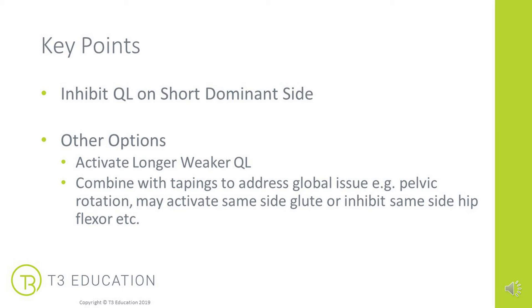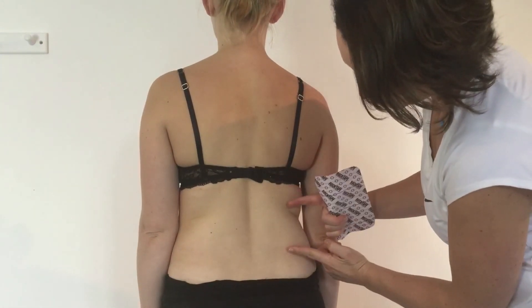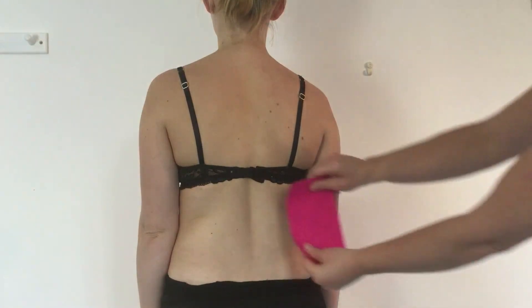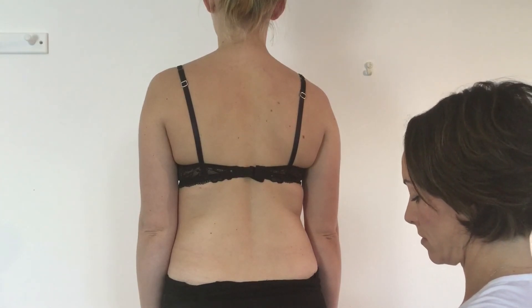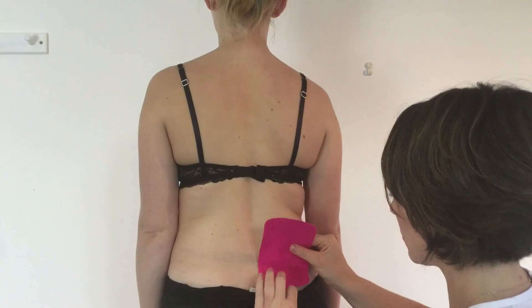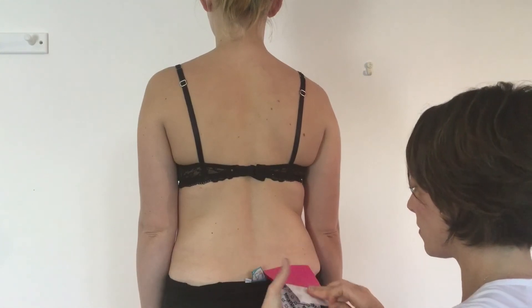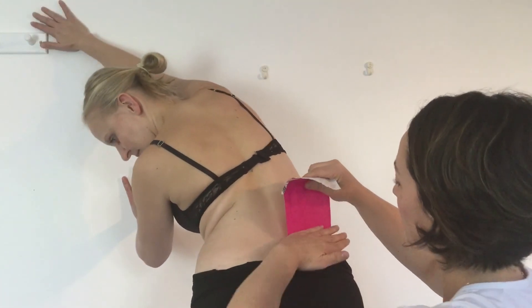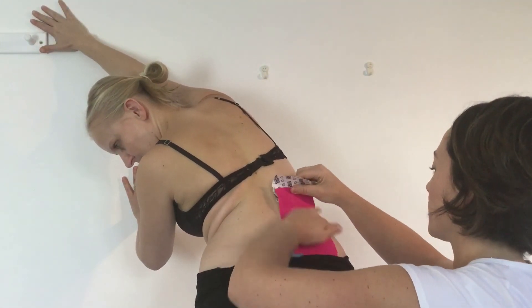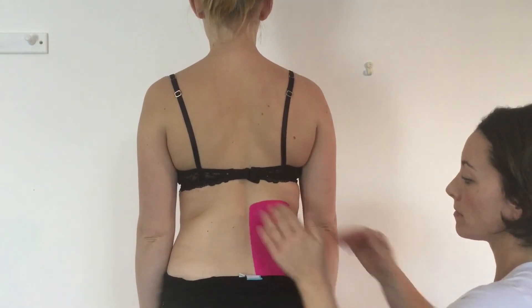Let's look at the kinesiology taping technique to inhibit the QL on one side. I'm going to use a 10cm piece of tape, but you could use 5cm or 2–5cm. The posterior iliac crest is quite wide, so I want to cover the whole of that origin. I'm going to anchor the tape on the origin. For inhibition, I'll peel back the middle of the tape — the active piece — add a light amount of stretch, and get my client to side bend and reach away to put the tissue on stretch. Rub the tissue down to stick, then get your client to relax the tissue and simply anchor the tape with no pressure.